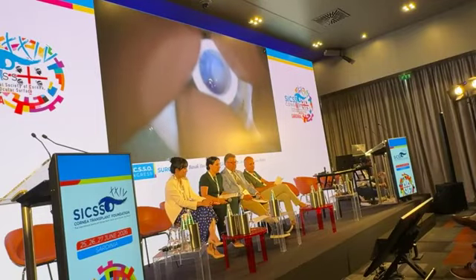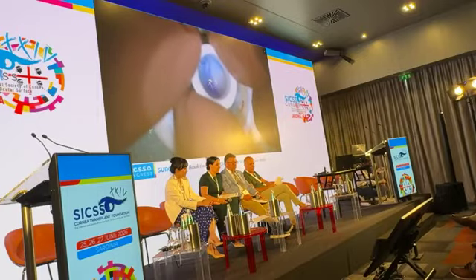So we discussed before whether Dr. Bezek usually does a peripheral iridotomy or iridectomy or not during the DMEK surgery. As you can see, he has not performed it. We have checked before the surgery in the patient, like during a normal visit, the dilation of the pupil, so the diameter of the pupil during dilation.